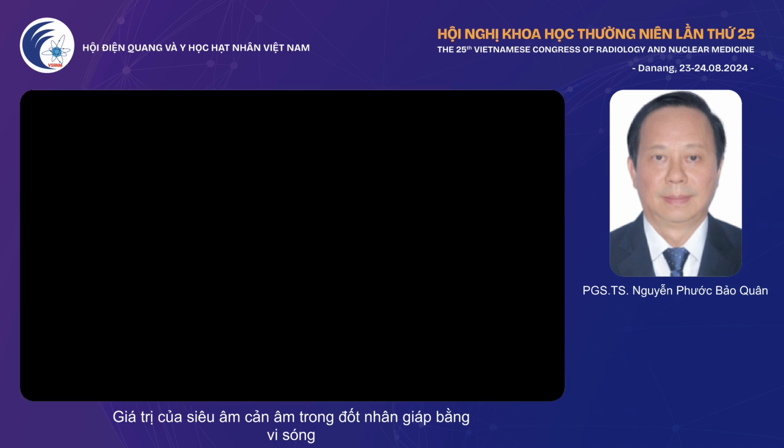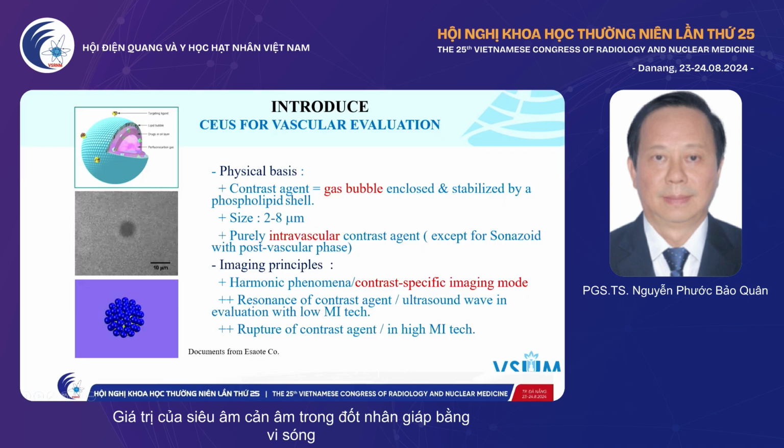Now we move to a new technique for investigating microvessels. We use CEUS, contrast enhanced ultrasound.